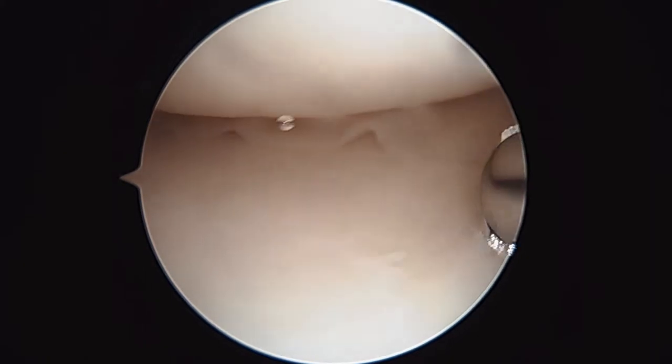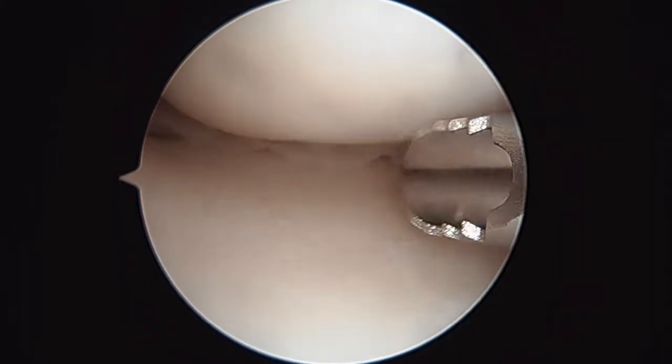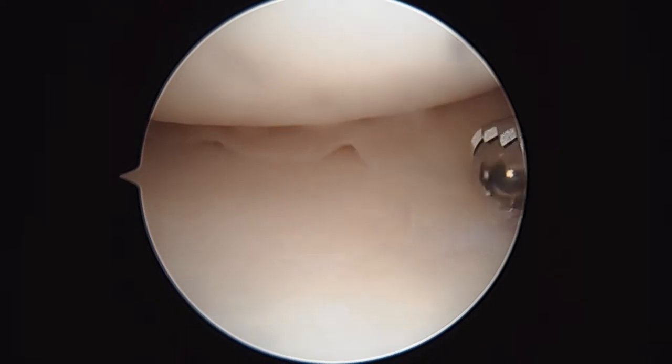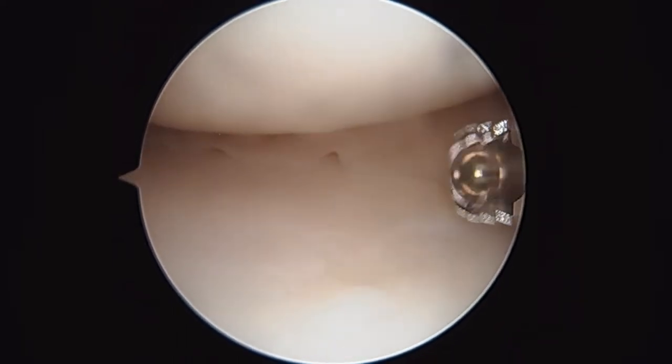Hi, it's Dr. Buford. We're just getting started on the right knee. We've already done a bunch of work like we talked about — the lumbar facet injections, the epidural, and gotten some bone marrow, which we're going to use as part of our meniscal repair augmentation.